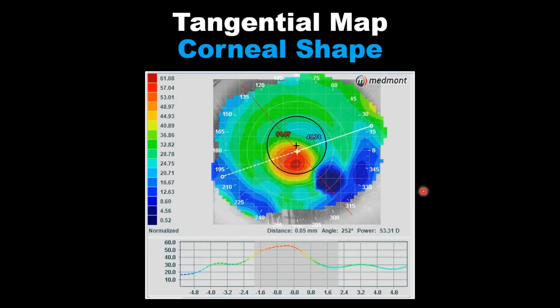Let's look at the same cornea in the tangential map — what we see is that the cone is very centered to the pupil. Remember: the tangential describes corneal shape, it describes where the cone is, what is the size of the cone, what is the shape of the cone.